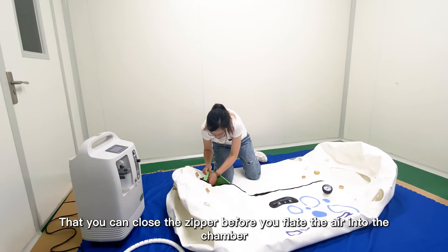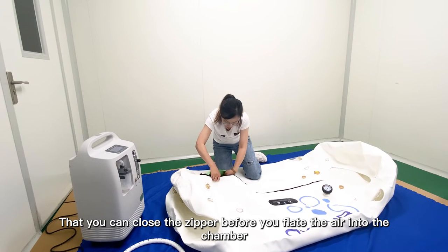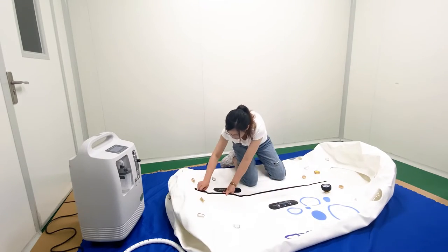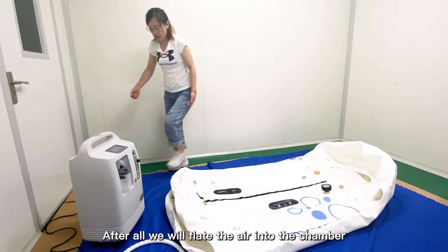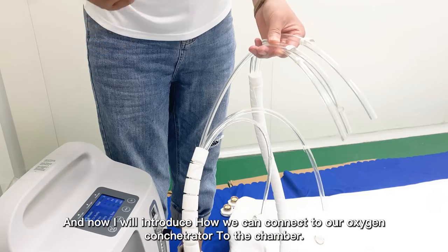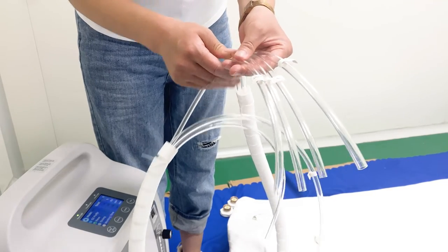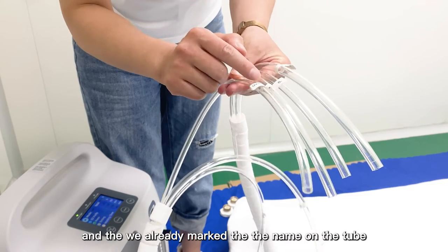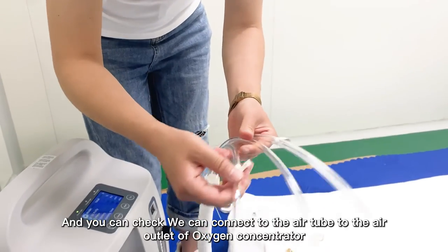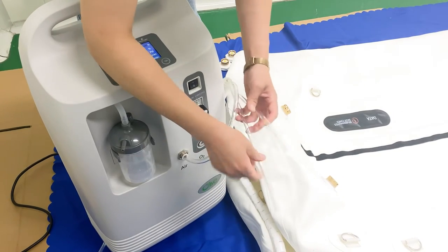After that, close the two-layer zipper before you input air to the chamber. Please remember we have two-layer zippers, so you must close both. Then we will input air to the chamber using the three pieces of air tube. The tubes are labeled — this one is the oxygen tube, this one is the air tube, and this is the spare. Connect the air tube to the air outlet of the oxygen concentrator, and connect the oxygen tube to the oxygen outlet. Air connects to air, oxygen connects to oxygen.